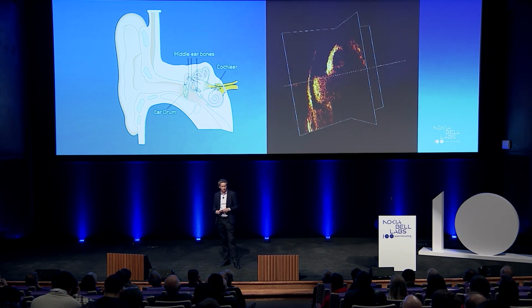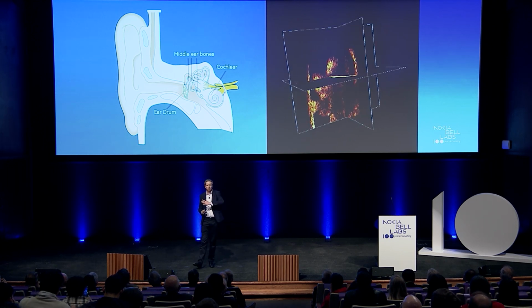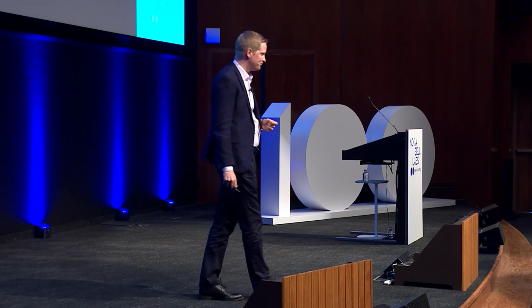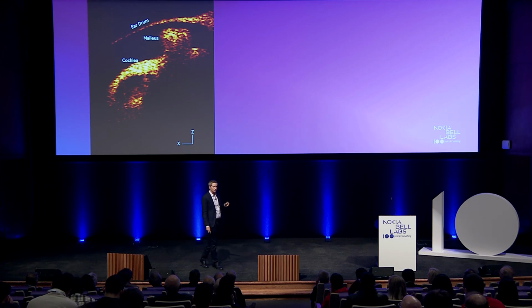So with our OCT device, we've tested this in mice. This is a live mouse ear. You can see the tympanic membrane, you can see all of the structures of the middle ear, and this whole scan took about 2 seconds to make. And so with this technology, not only can you see all the structures, you can see the eardrum, you can see behind it. If there's fluid, you can actually tell if it's bacterial infected, if it's a viral infection, if there's strange growths, you can see it. In seconds, the clinician can now actually see what's wrong.